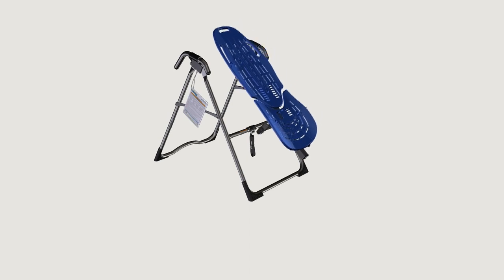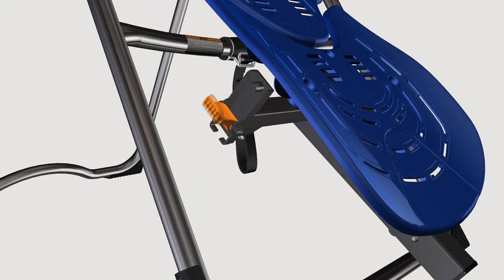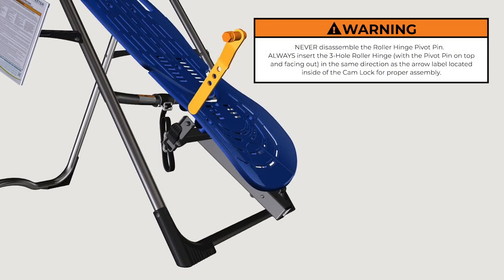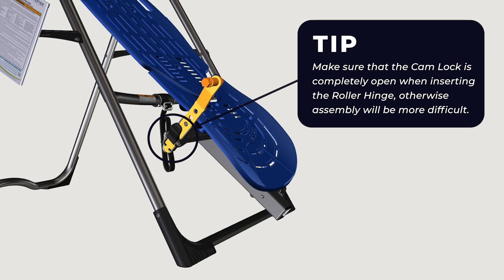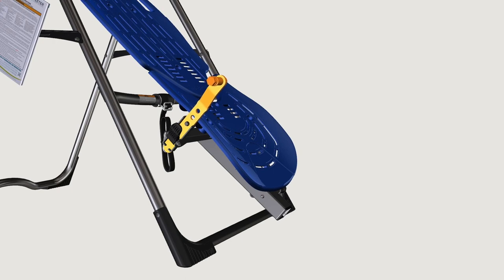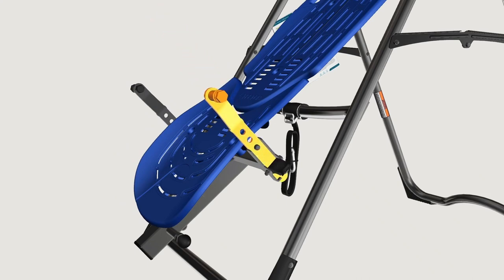For ease of assembly, rest the table bed against the crossbar at the front of the A-frame. On one side of the table bed, lift and hold the cam lock up all the way to unlock. In your other hand, hold one roller hinge near the pivot pin. With the pivot pin facing out away from the table bed, slide the bottom of the roller hinge between the cam lock and the bracket in the same direction as the arrow label located inside the cam lock. Make sure that the cam lock is completely open when inserting the roller hinge, otherwise assembly will be more difficult. Engage one of the holes in the roller hinge over the bracket pin, then push down on the cam lock to lock it and secure the roller hinge. Repeat on the other side and make sure the roller hinges are in the same hole setting on both sides.